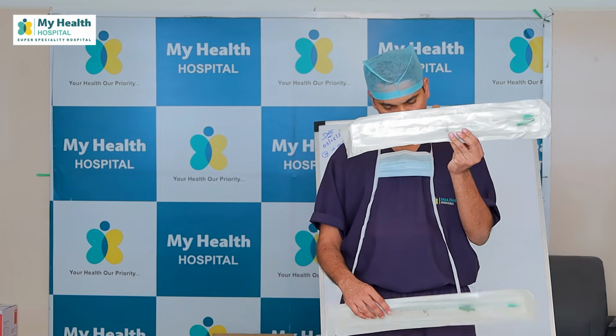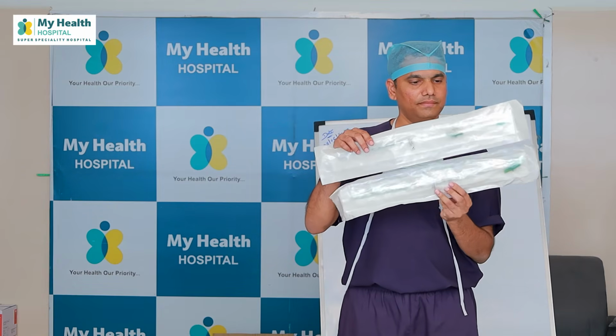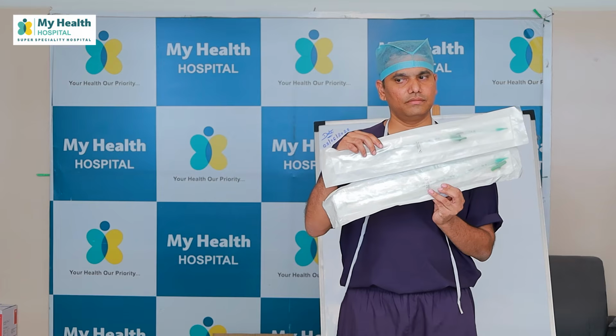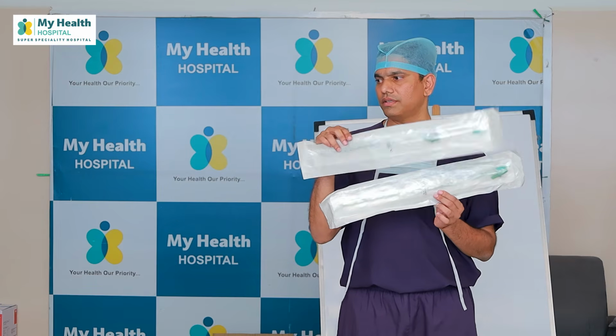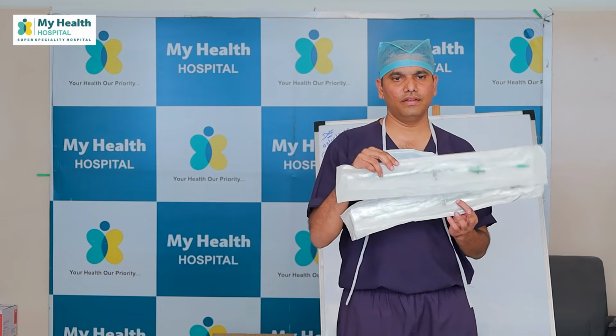Anyone? How do you differentiate all three? And what is this? Chest drain. All these three are chest drains.